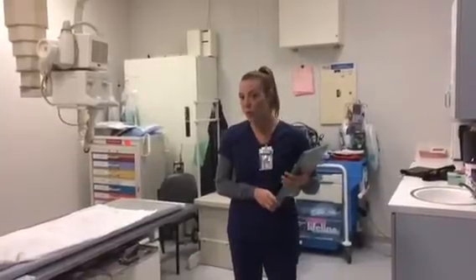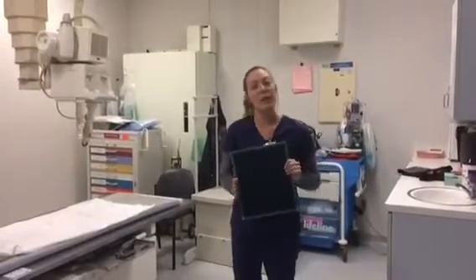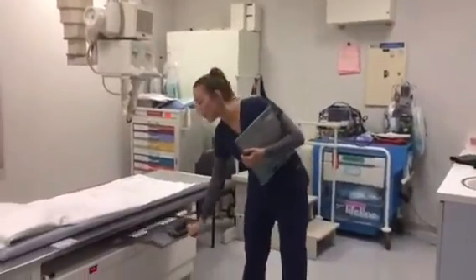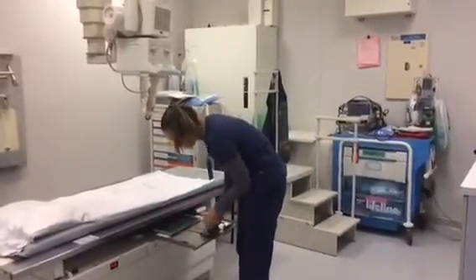For all three projections, we'll be using the same technique, and it's going to be a ballpark between 65 to 70 kVp, about 8 to 10 mAs, depending on the size of your patient. We'll also be using a 10 by 12 IR size for all three projections as well. We'll be using the table bucky.